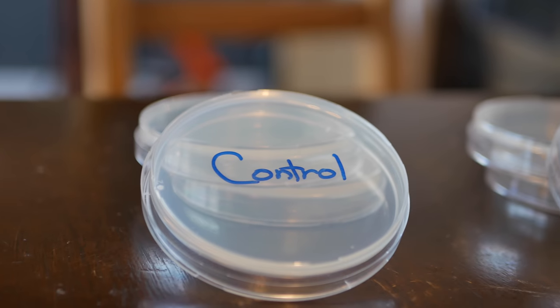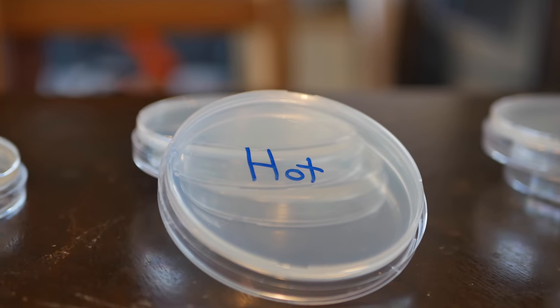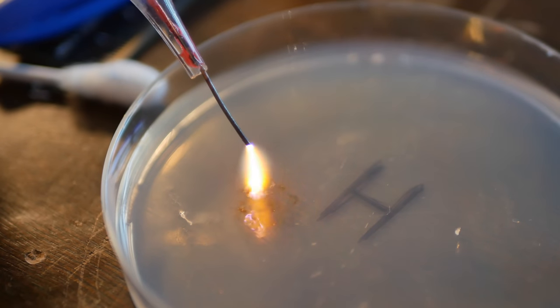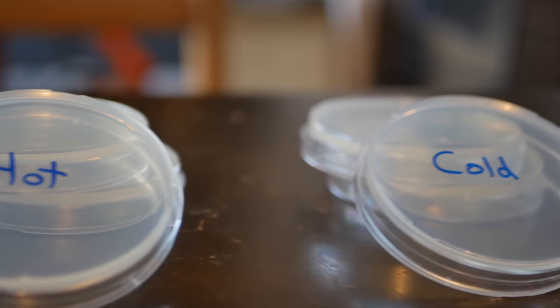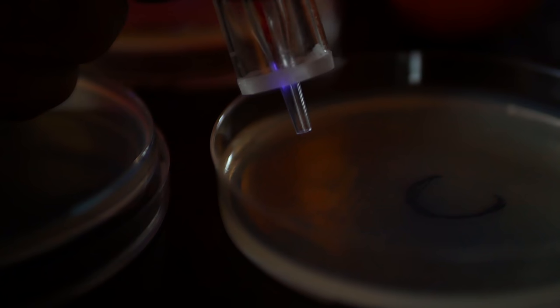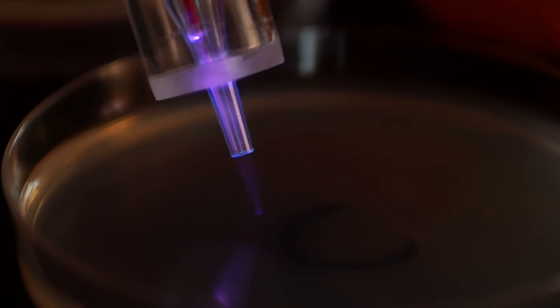The first group is a control, and, well, there's no treatment. The second group is treated with open-air hot plasma. Oh, look, it's vaporizing the surface. Big surprise. The last triplicate is treated with cold plasma. This is the little flame that could.